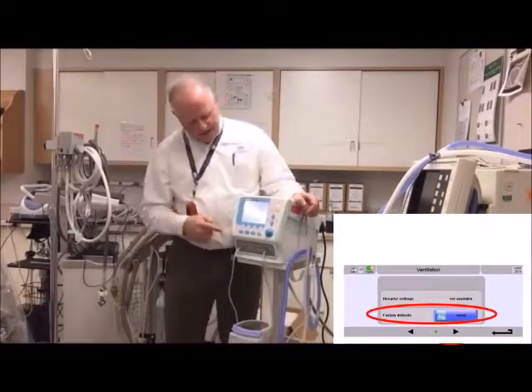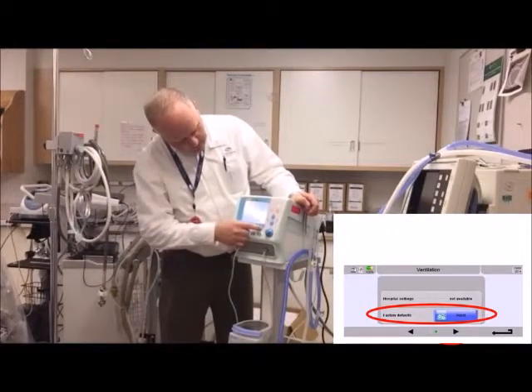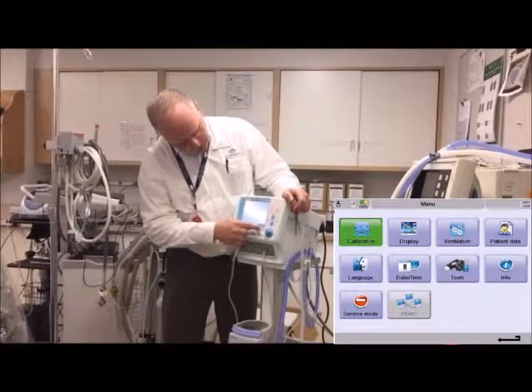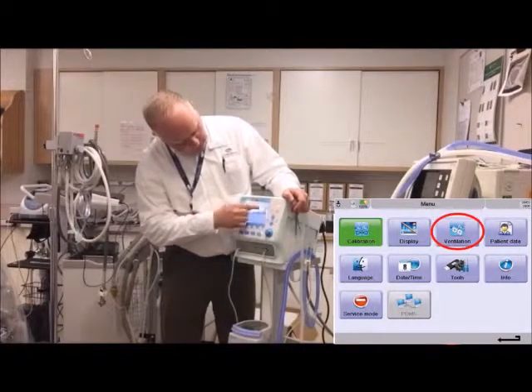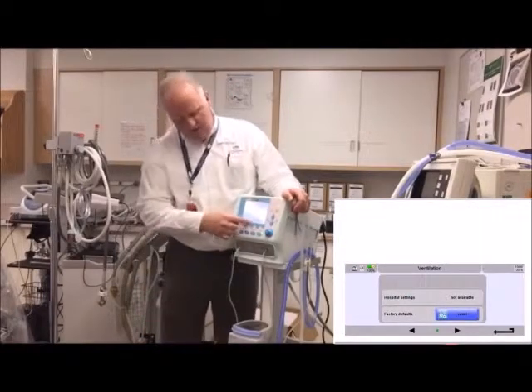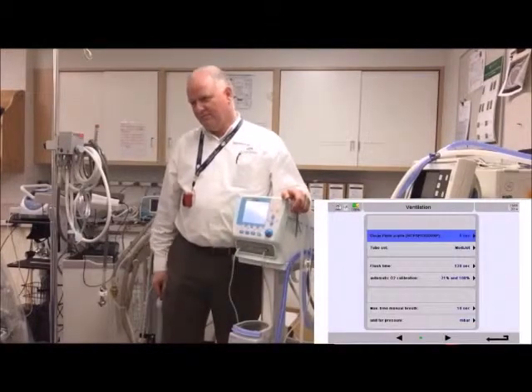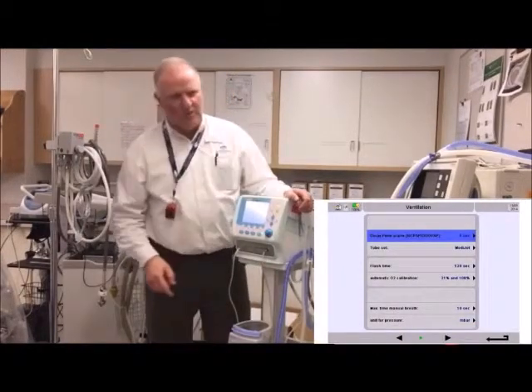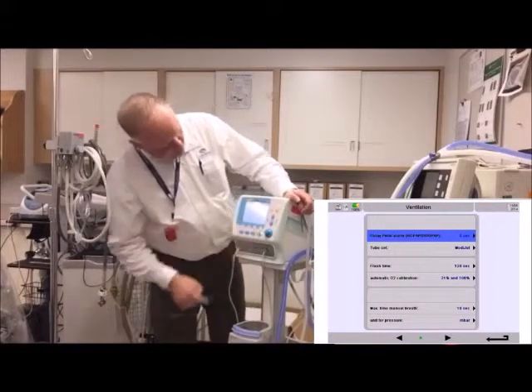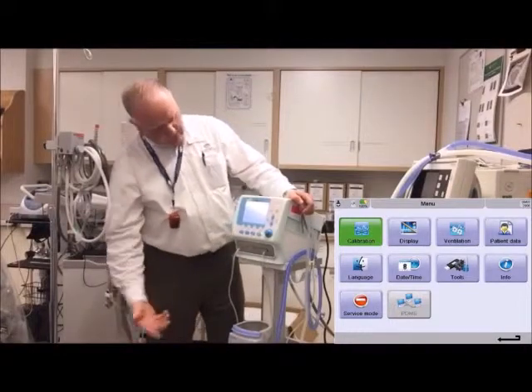One thing to be careful about: if you get out of this menu and go back, then want to get into ventilation settings, go down here and hit those two bars — that's where it is. Be careful, because that other screen isn't the right one; the arrows down there will tell you so.